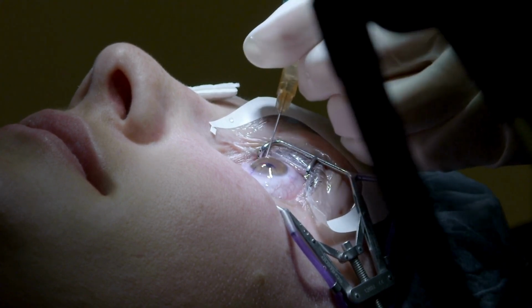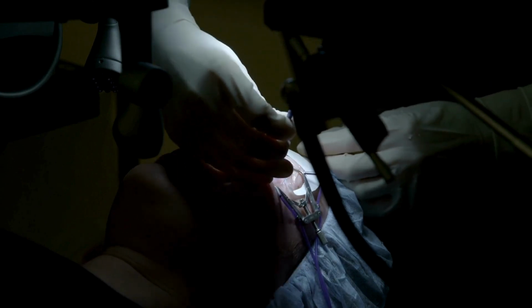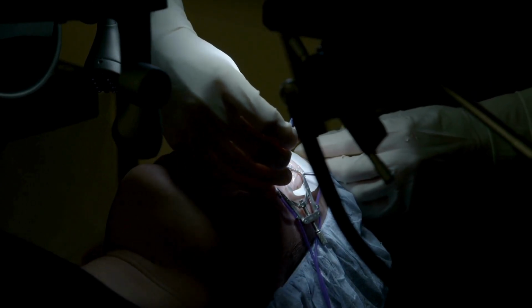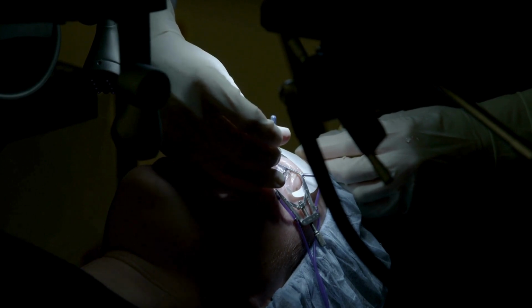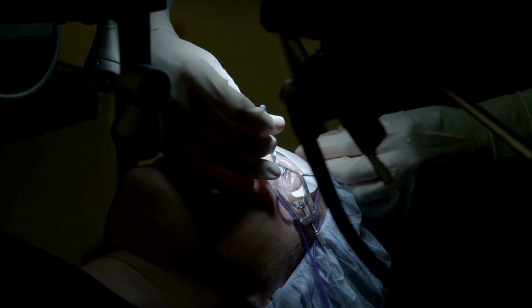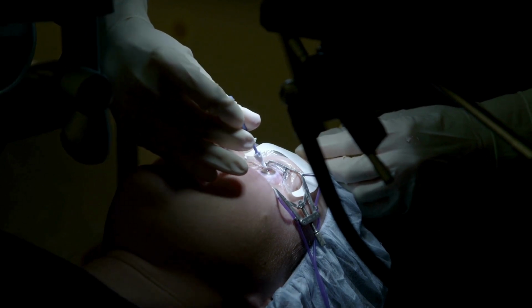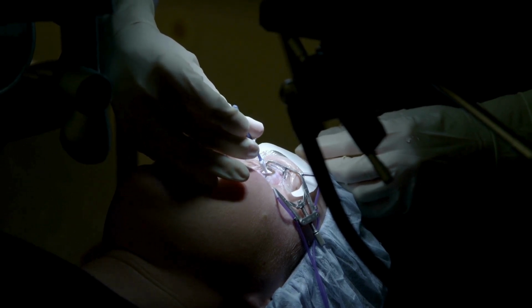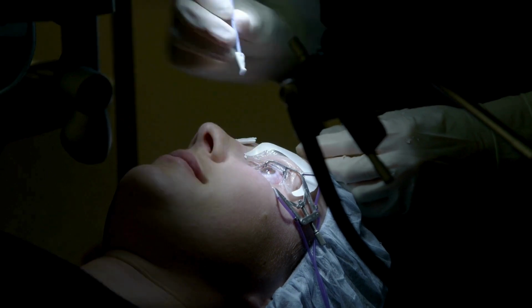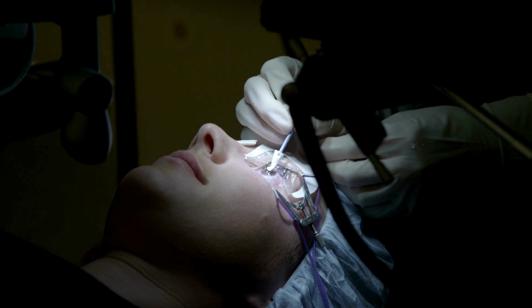Corneal topography could only capture the shape of the anterior surface of the cornea. Devices now combine technology such as scanning slit technology, Scheimpflug-based imaging, and anterior segment OCT to take slit images of the cornea and convey data on both the anterior and posterior corneal surfaces, rendering a three-dimensional corneal map. As a result, tomography-based corneal topography gives overall corneal shape profiles, including curvature, thickness, and elevation.